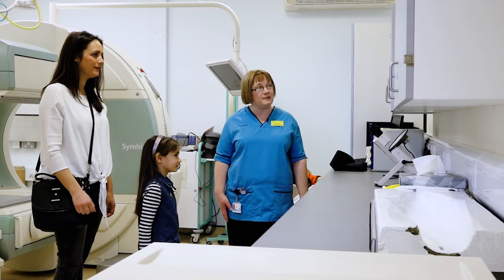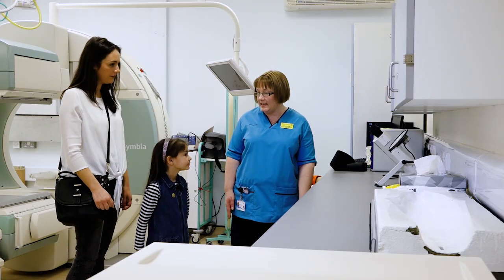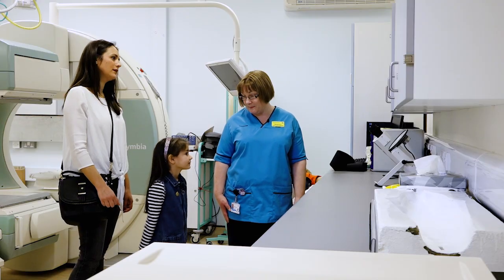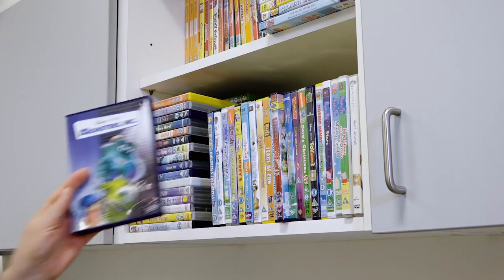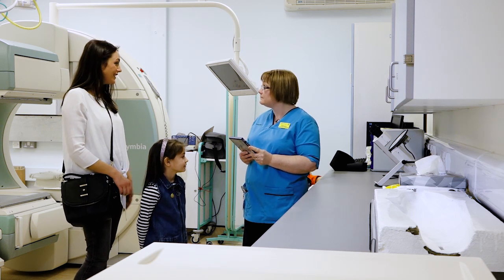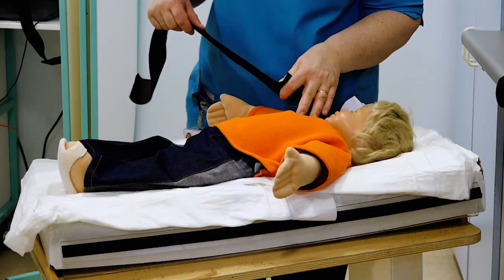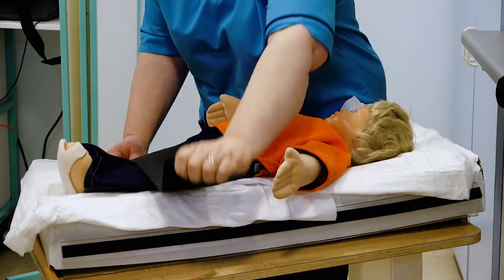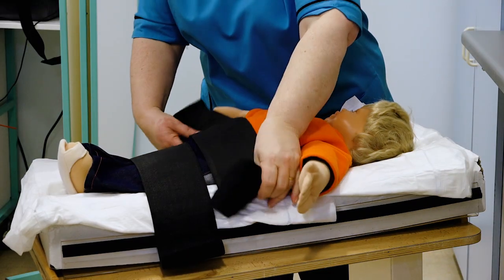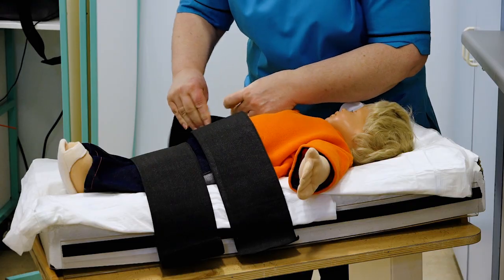What we would do now for somebody having a DMSA scan is get them to choose a DVD, because that helps them to lie very very still for the scan. For babies or toddlers, we put wee safety straps around them — one across the legs — and the most important thing is that parents stay nice and calm and try to reassure the child. They don't always stay still and do sometimes get upset.